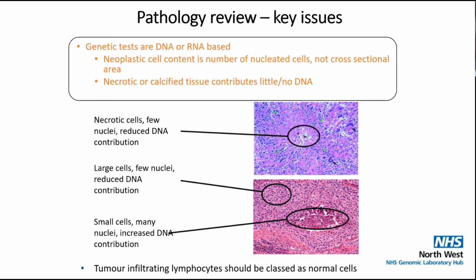So those are the kind of materials we extract. A few slides on how a pathology review before the samples come to genomics can really make a difference, and how, when we're asking for particular information, that information is used and what difference it can make.